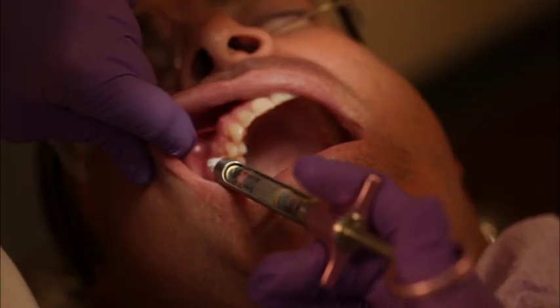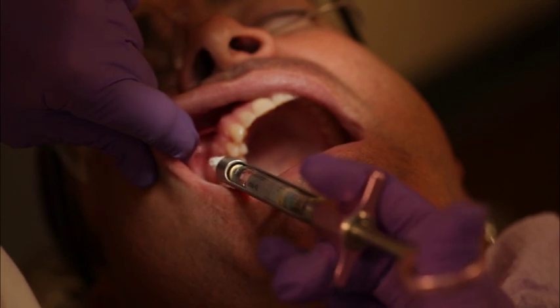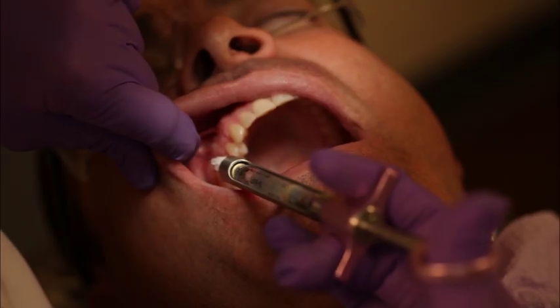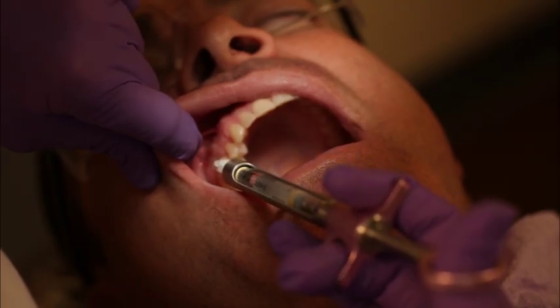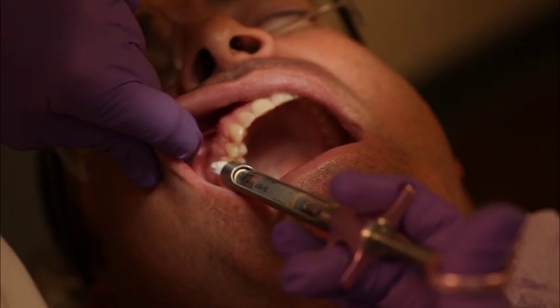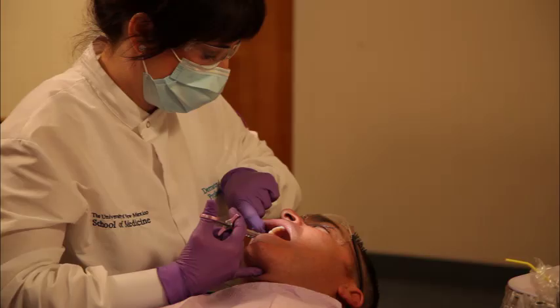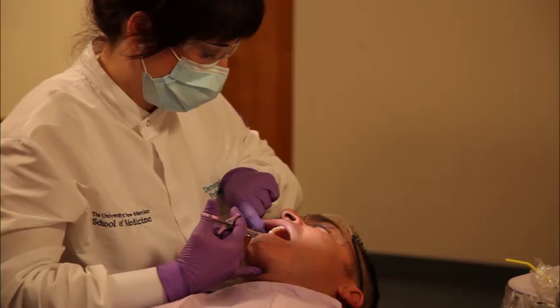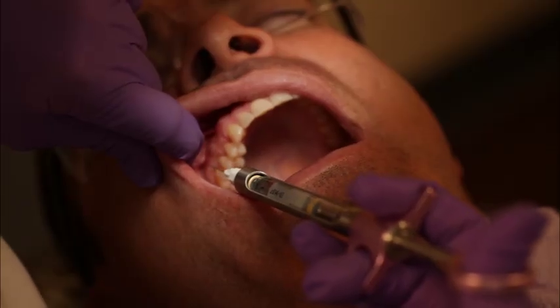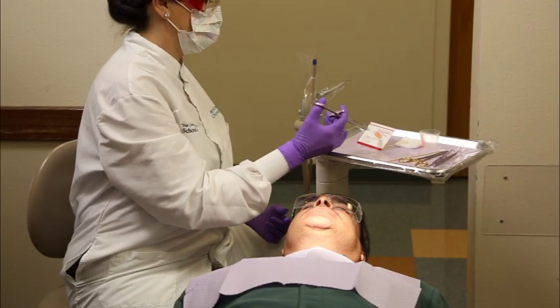Aspirate by pulling the thumb ring back gently 1 to 2 millimeters at the injection site to prevent the possibility of an intravascular injection. If a negative aspiration is achieved, slowly deposit approximately 0.9 to 1.2 milliliters of solution, or 1/2 to 2/3 of the cartridge, over approximately 60 to 90 seconds. If the tissue balloons, the injection is too rapid. Carefully withdraw the syringe and immediately recap the needle using the one-handed scoop method with a needle sheath prop or other recapping device.